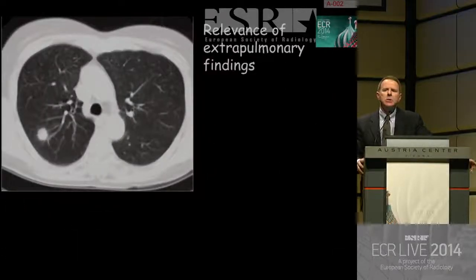And you keep going. Another patient, central lesion. Are these lesions at risk of pneumothorax? For sure. A 2-centimeter lesion, central, risk of pneumothorax is there.